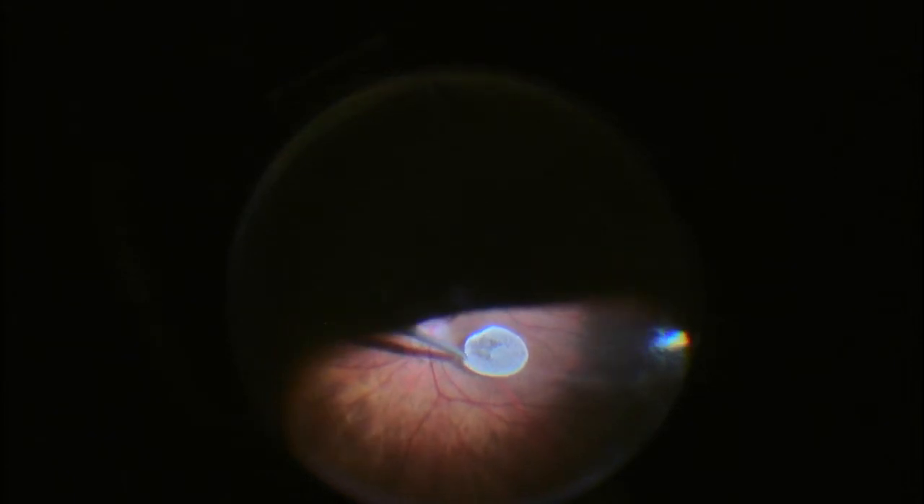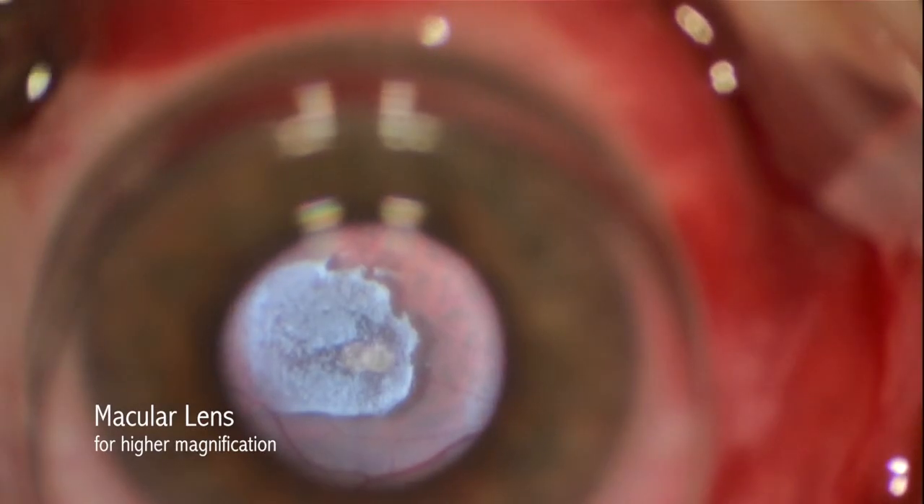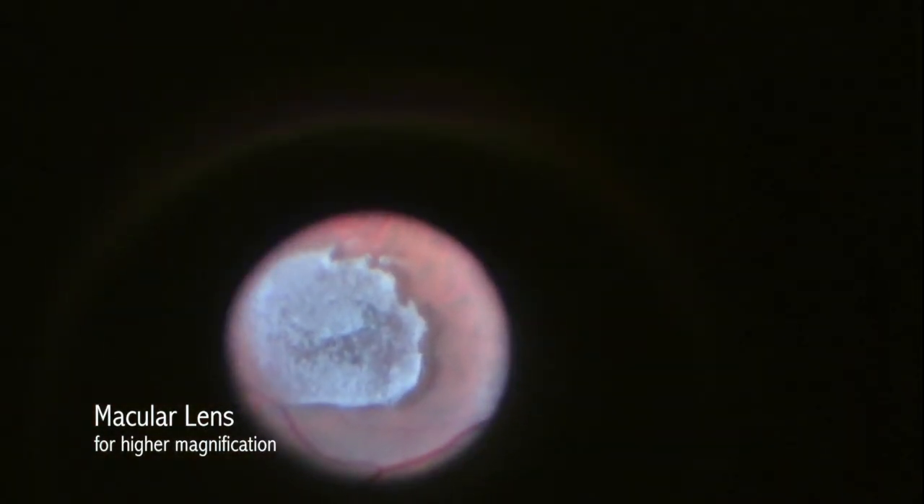Multiple other techniques, utilizing aspiration both over the optic nerve as well as temporal to the nerve, are unsuccessful.